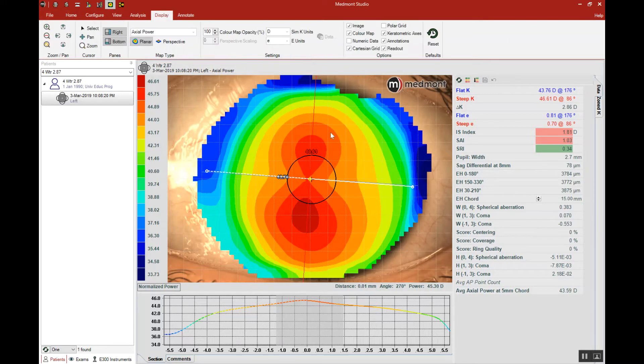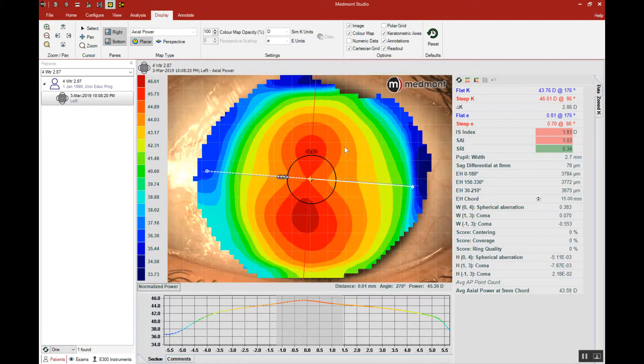Here we can see a patient with regular with-the-rule astigmatism, a very normal figure eight, a very symmetric eye shape.